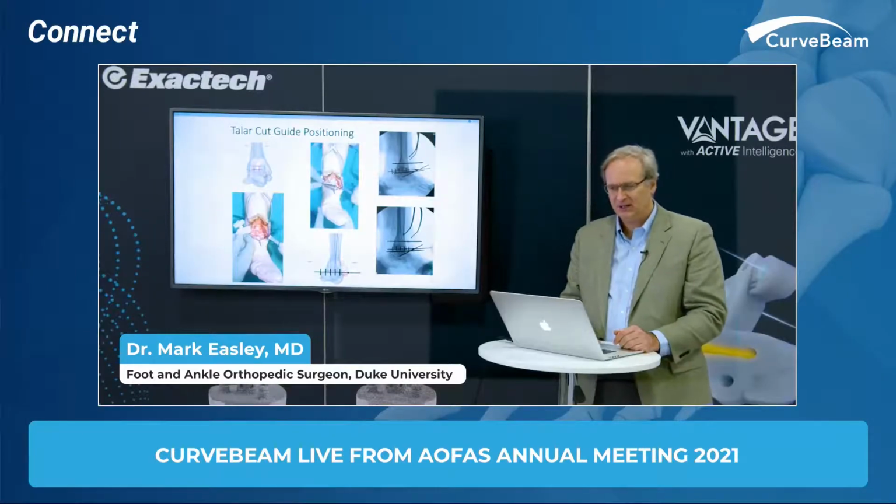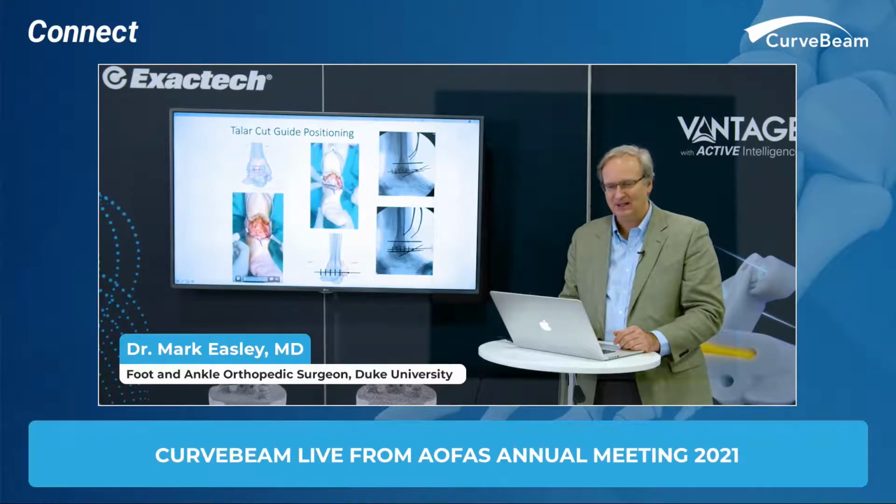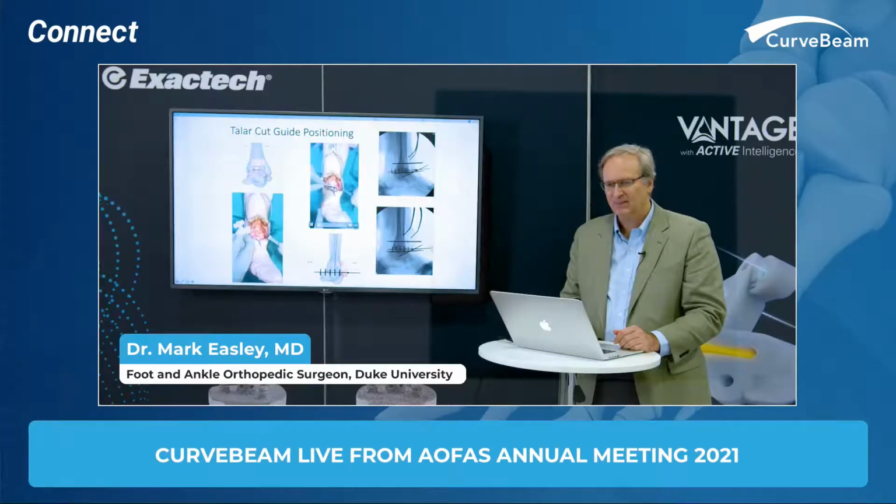And so you'll see it here, it's sitting in position. And again, to me, I thought that was absolutely fascinating that I then made a cut through. The cut's actually going to go through the tibia again. And again, no sweat with this. It sits perfectly fine, and I end up making a perfect cut on the talus with this. You can see that here. And then once I line that up, it's exactly through the tibia and through the talus. And that was just the point of that.